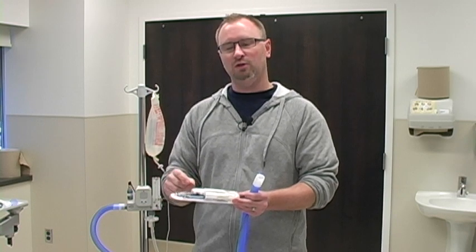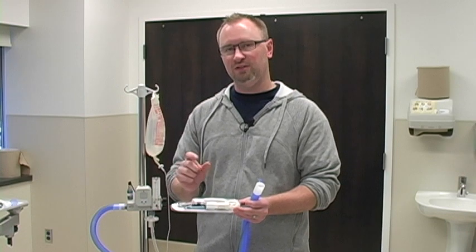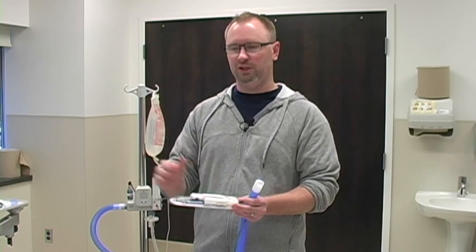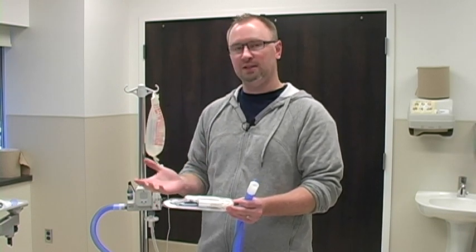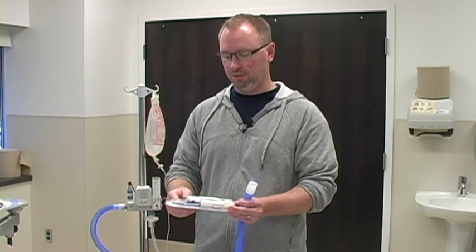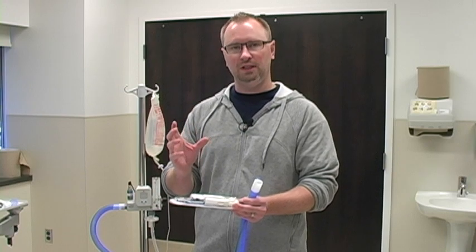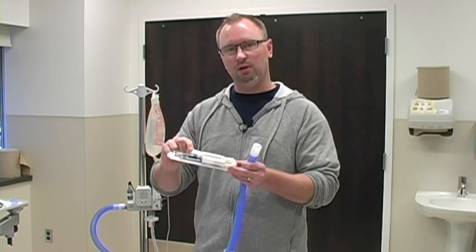What you're shooting for when sizing it for the patient is you don't want to have the nare more than 50 to 70% occluded. So you don't want it sealing perfectly in there because then you're creating a CPAP type system. What you'd like is a free-flowing, high-flow oxygen setup with gas being able to flow around. So half of the nare, roughly, is what you'd look for. So you can just sort of eyeball it with your patient.